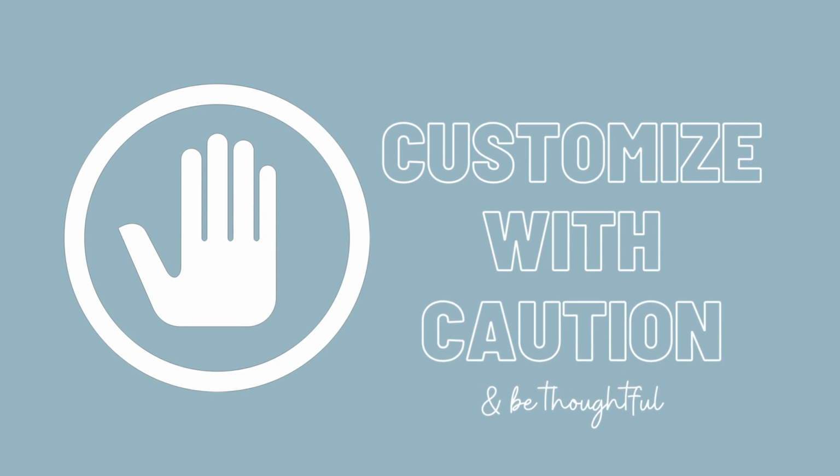A quick reminder though, before editing, the placement and location of buttons is very important in your child's language development and learning. It's important that we are thoughtful in where we add buttons and that we never remove or move a button that is already there. Moving buttons can disrupt the motor plan your child has. We also want to be cautious and have conversations with your SLP before making changes to the home page.